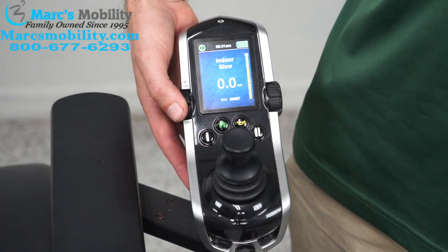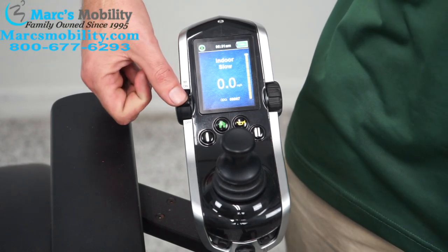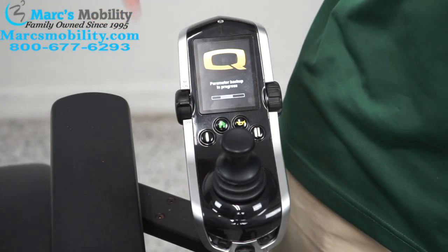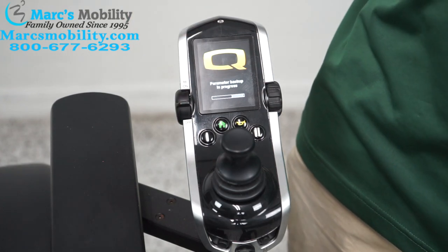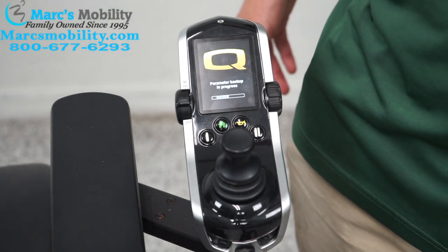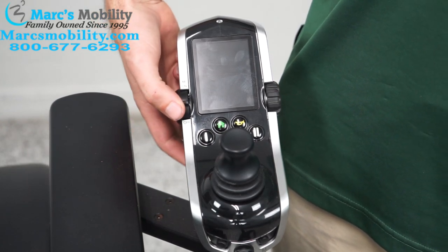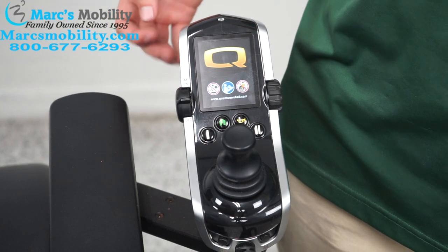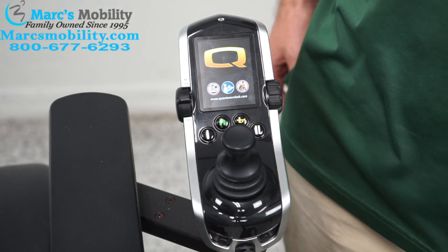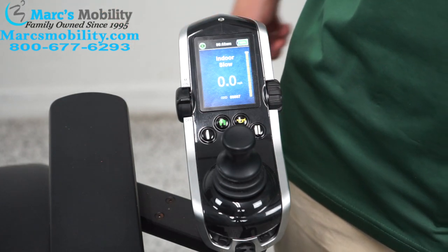I'm going to go over powering on and off the joystick. To power off, take this switch and push it down — the joystick powers off and that is all it will do. The chair may save a setting, so you'll need to wait for that to finish. To turn the chair on, push the switch up. You can see the chair power on — wait about two seconds before pushing the joystick, or it will recognize the joystick as out of position. And here we are, back to where we were.